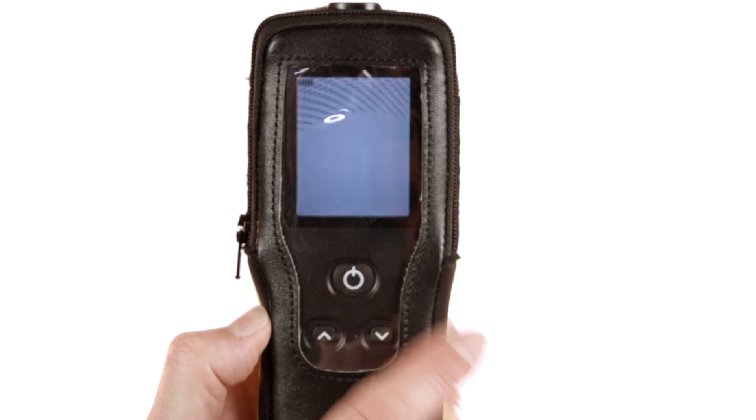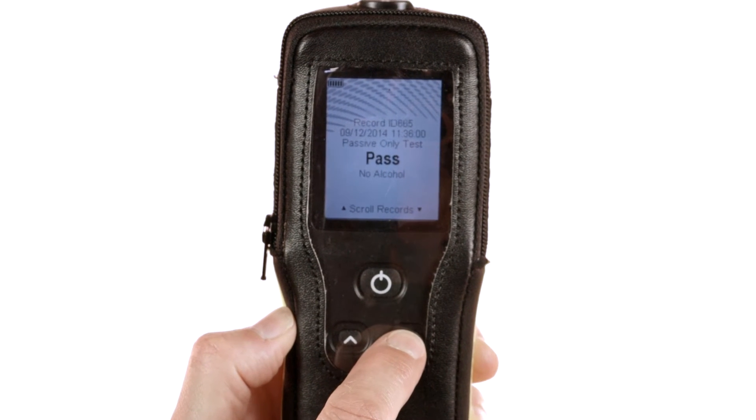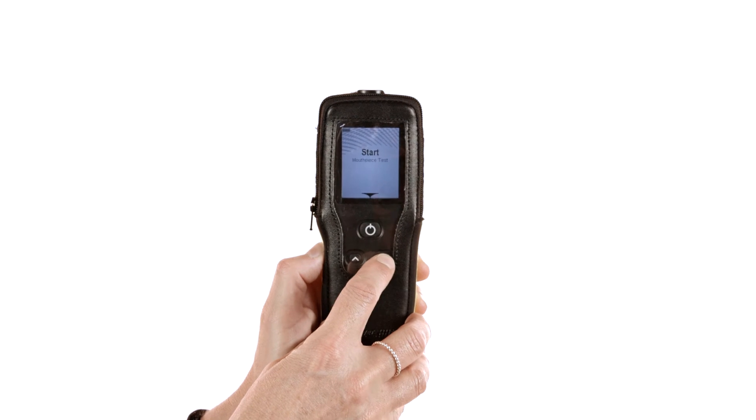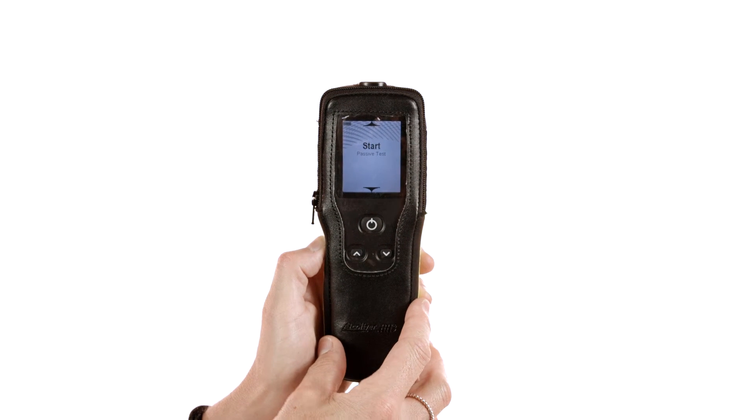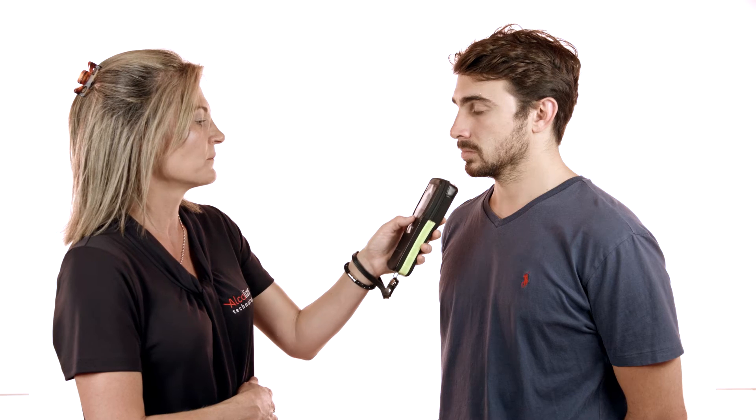Users can access the HH3 user menu to find records and view the stored breath test results. To make a passive test, simply select the start passive test option on the menu. To carry out a passive test, the subject simply talks towards the instrument.